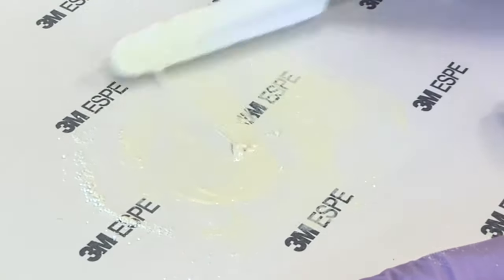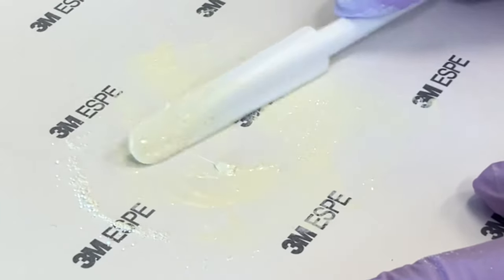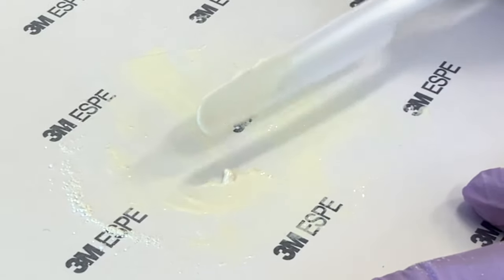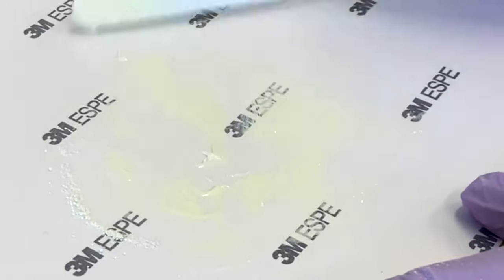The final mix should pull up from the spatula slightly before it breaks. This sealer is advantageous due to its long working time. Gather the sealer into a pile and prepare for the next step.